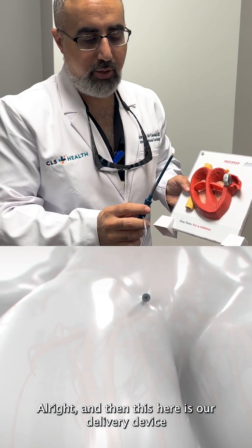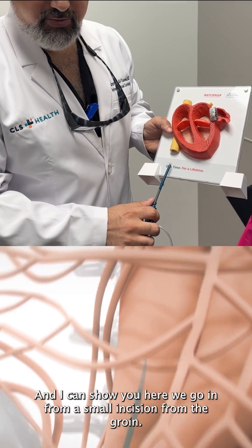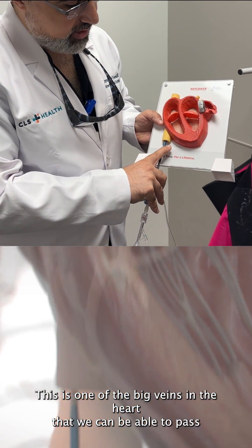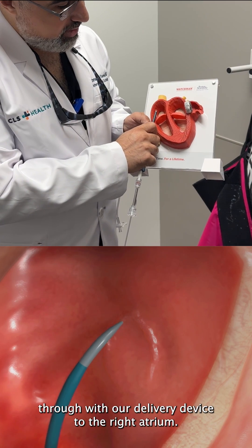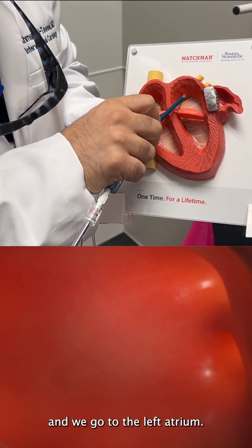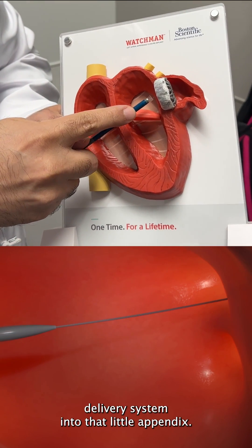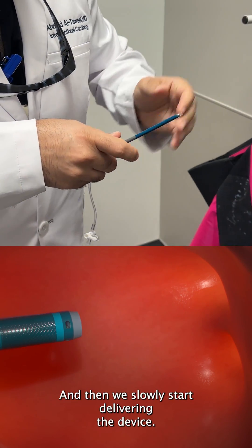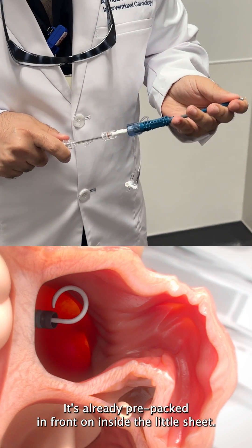This here is our delivery device for the Watchman occlusion device. We go in from a small incision from the groin. This is the heart again — this is one of the big veins that we pass through with our delivery device to the right atrium, and then we go through what we call the septum here in the heart, and we go to the left atrium. After that we put our device delivery system into that little appendage and then we slowly start delivering the device. It's already pre-packed and crimped on inside the little sheath.